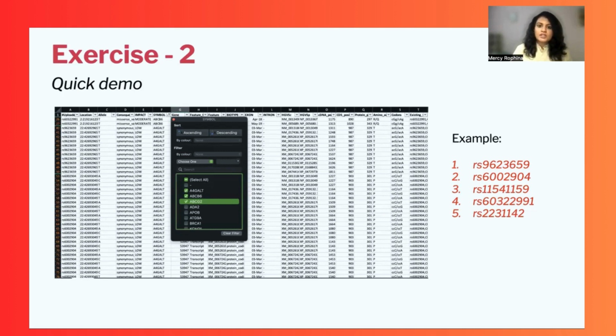This list of 51 genes can be obtained from multiple resources. Like I previously mentioned, the ISBT resource gives a complete list of all these 51 genes. We will filter only those genes belonging to the blood group gene category, so that we are left with only the variants present in these genes. When we do that, out of the 10 variants which I had previously shown, we have only 5 variants which can be categorized as blood group related variants.